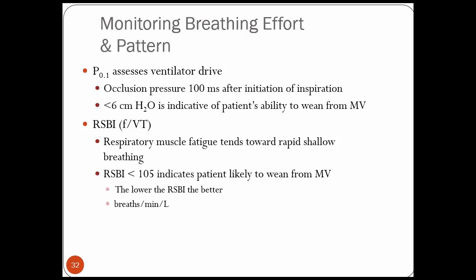So when you put in the tidal volume, that needs to be in terms of liters, not milliliters. So you have to use 0.5 liters instead of 500 milliliters.